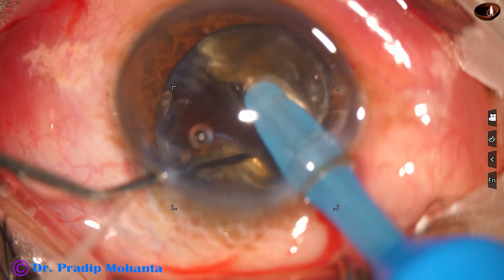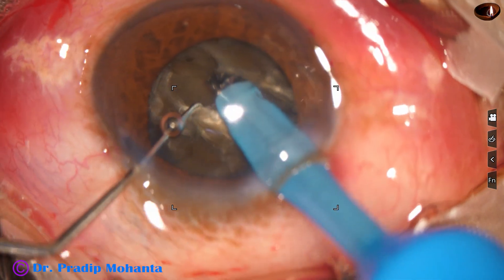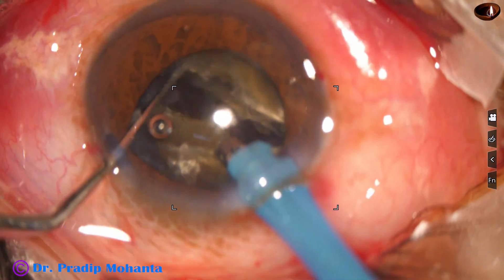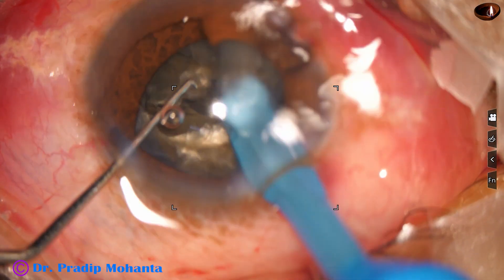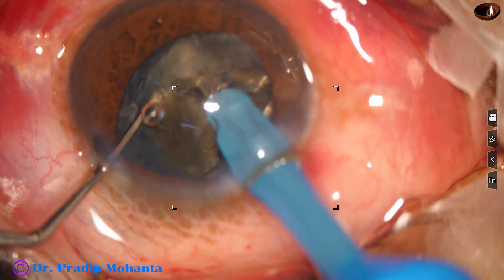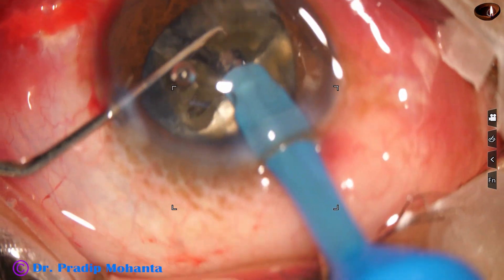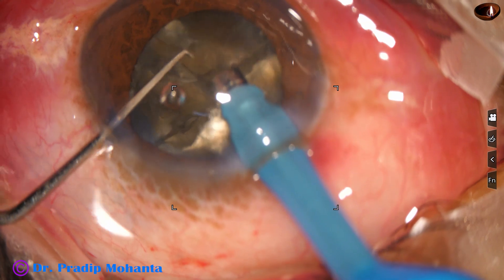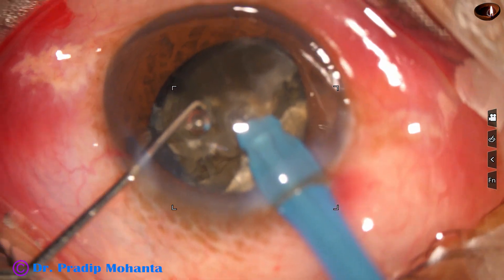The chopper is used to get a nice crack. It is Mohanta's chopper — a modified Sinskey hook, a little stronger and a little thicker. I do multi-level chopping with this: first a crack, then I go to a deeper level and divide the nuclear pieces. One hemi-nucleus has been divided into two parts, and now each part is being subdivided and emulsified.